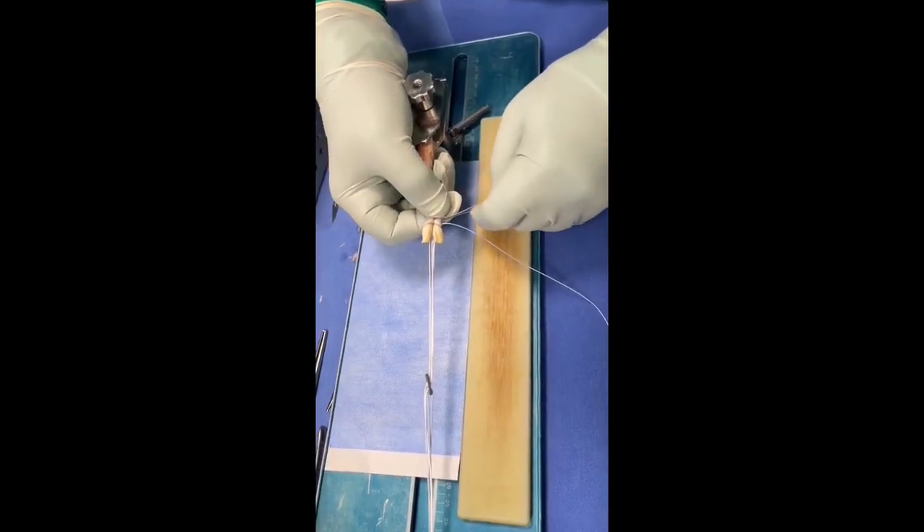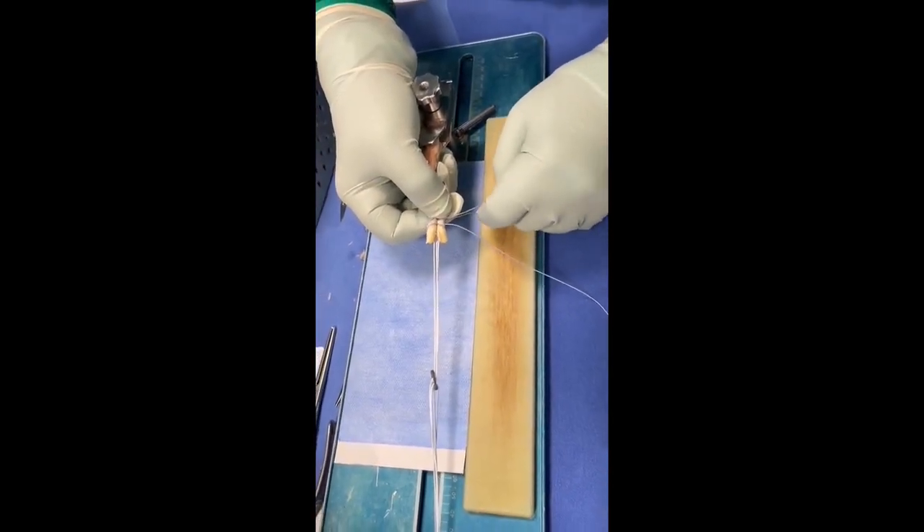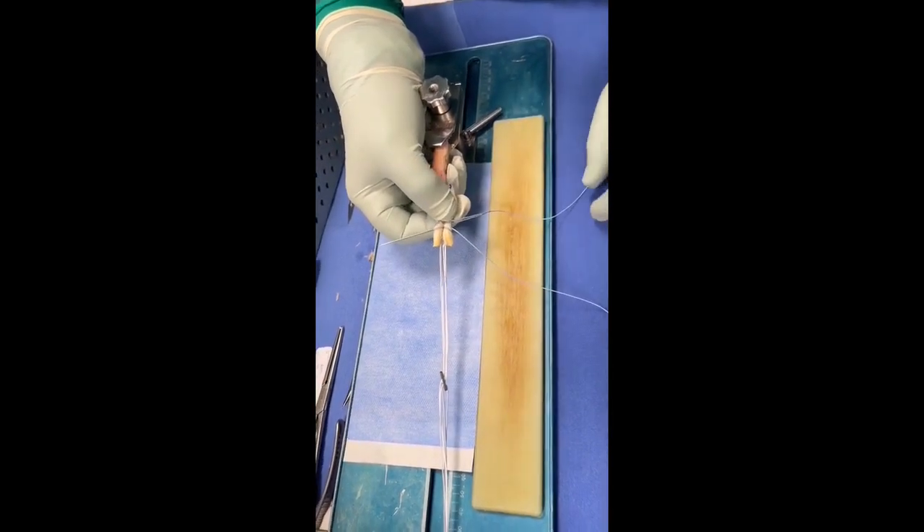Then, the tendon end of the graft is made tubular so that it enters the femoral tunnel.